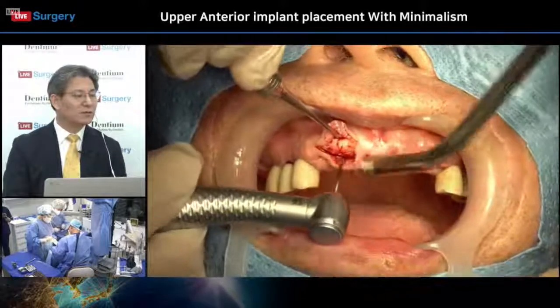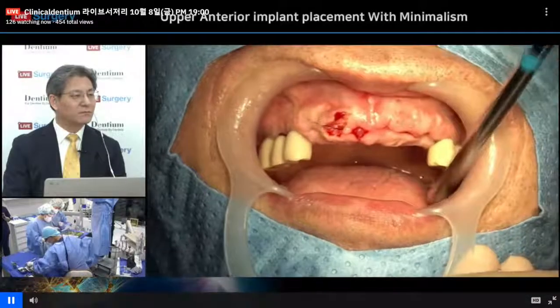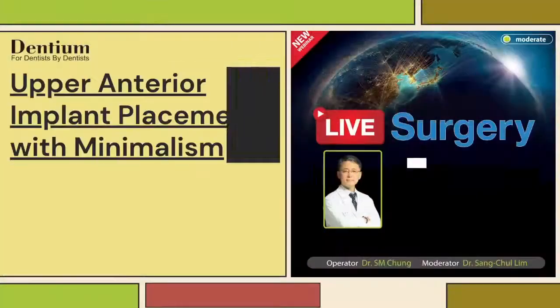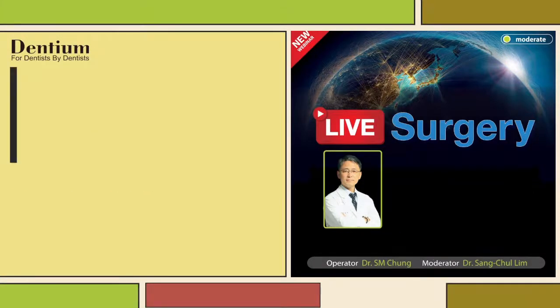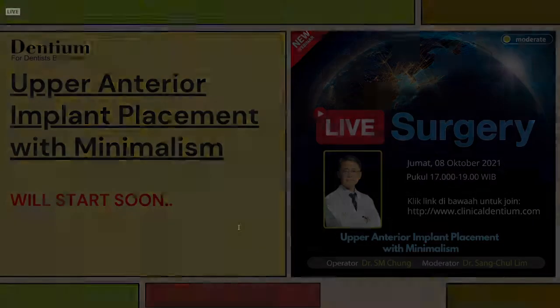At first, I will position the drilling site with a high speed. He is going to use a high-speed fissure bur, making a starting point. After that, especially in the upper anterior side, in most cases we use extension drills, because with the extensions we can see the angulation much more exactly. He used the extension drill. This promotes the right angulation during implant installation. When you have an anterior implantation, this extension drill is a necessary part.